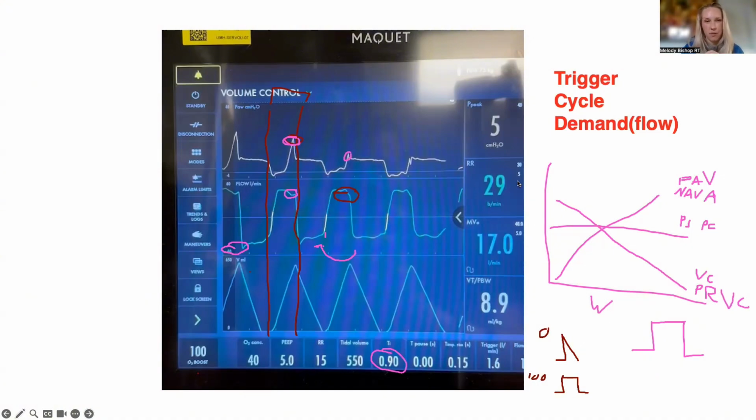If you have a patient that is very light, sometimes you have to be a bit wider because otherwise it's going to be nuisance alarms and you can't have that. But the textbook says 20% above and below. Interesting. All right, good, so now I know. Now I can tell the RTs that it should be 20% above and below. You're going to get hate. No, well, they're going to be like, who told you that? I'm saying Canadian respiratory therapist. They won't even know who you are, so it'll be fine.